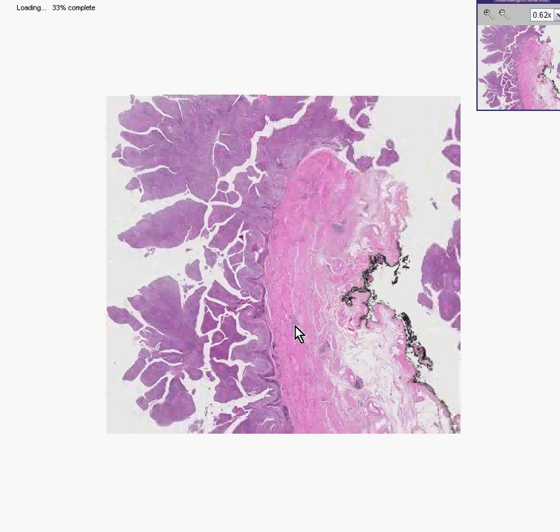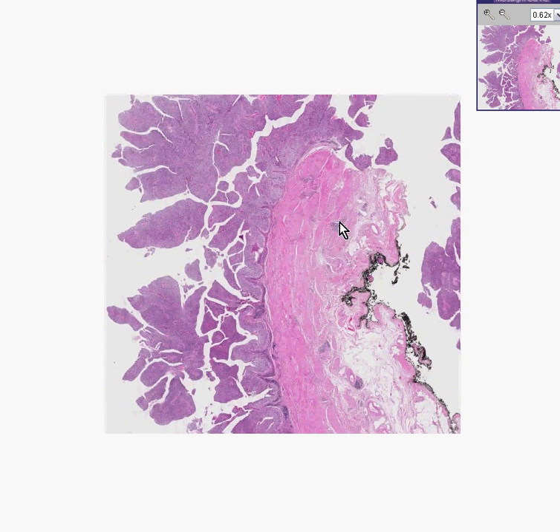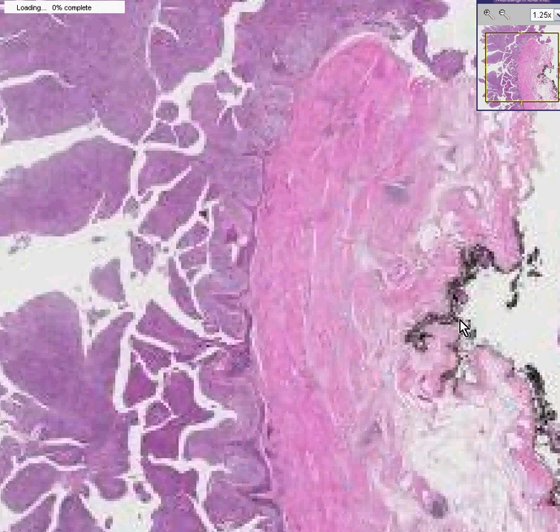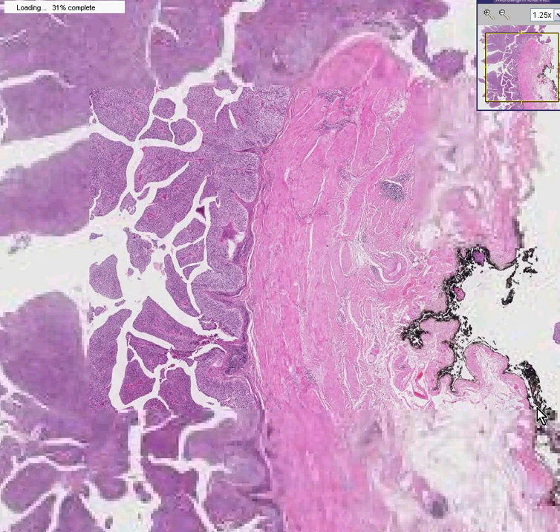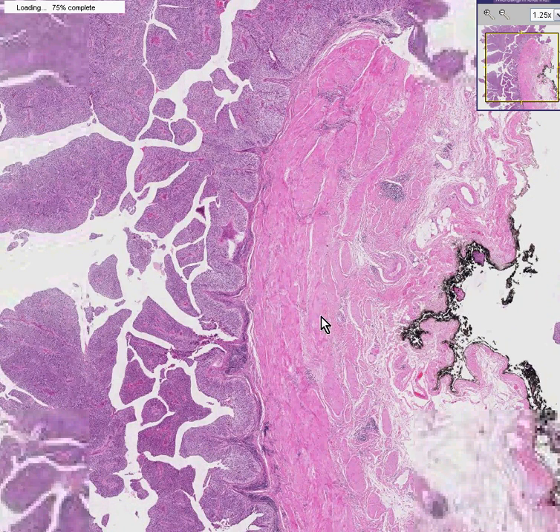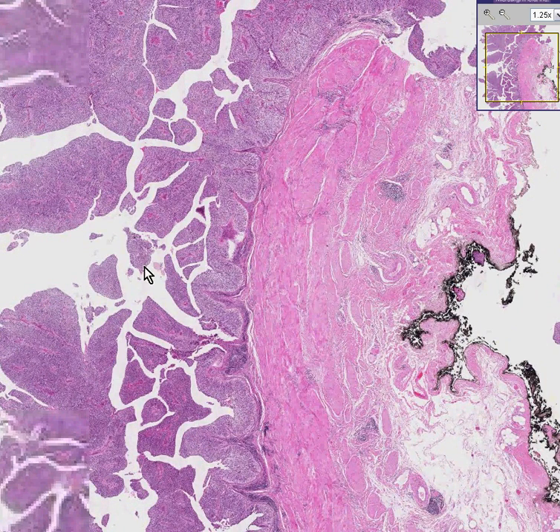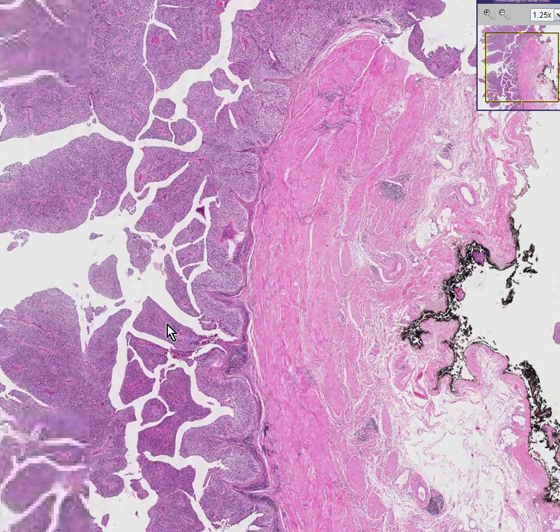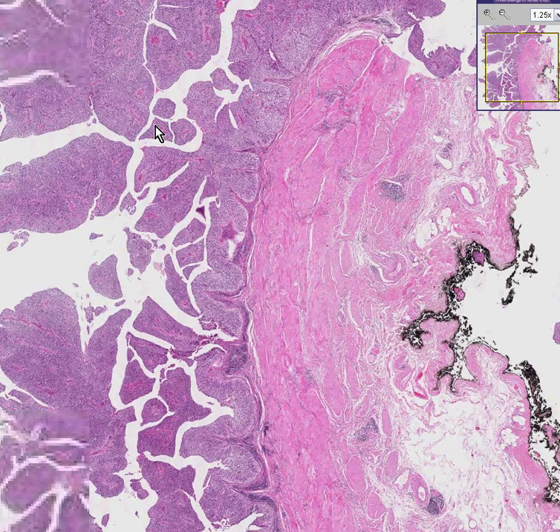Here is the smooth muscle of the ureter. Here is the outside of the ureter, which has been nicely India-inked to see if any of the tumor cells extend to the outside of the ureter. Here is the smooth muscle, and then here is the tumor in question. Notice clearly the tumor has a papillary configuration. Here's a papilla, here's a papilla — defined as a fibrovascular core surrounded by epithelial cells. Let's take a look at some of these papillae in closer view now.